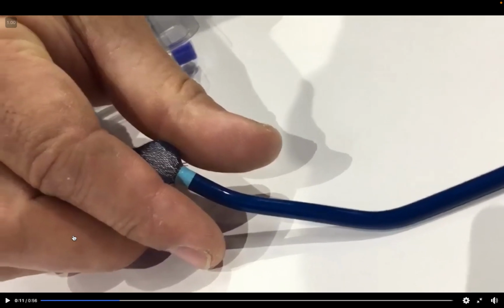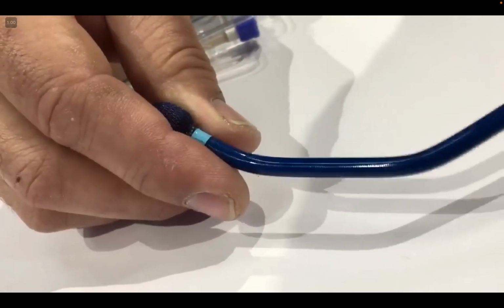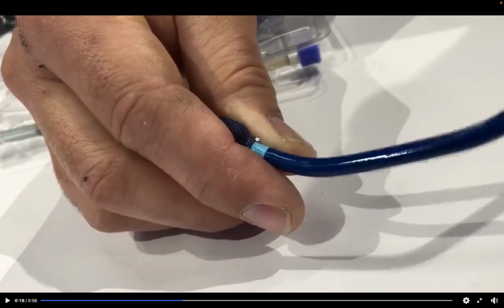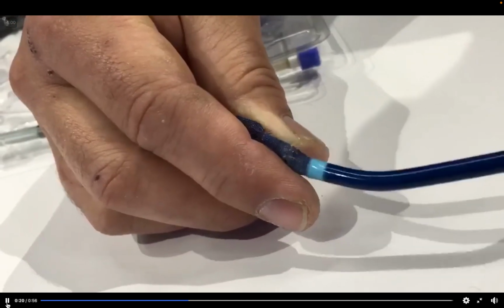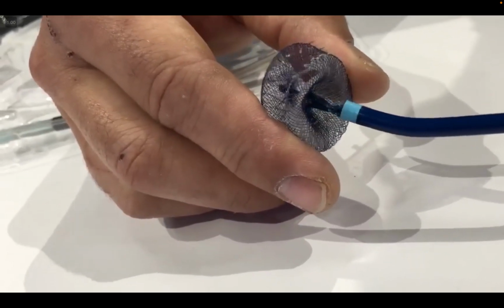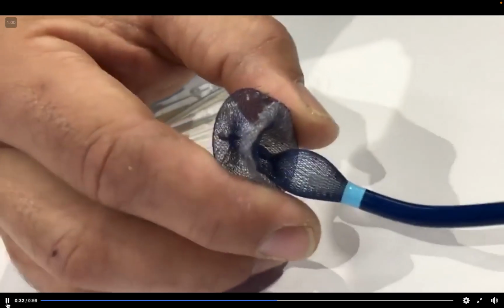So you can see the self-expanding nature of this actual device through this outer sheath. I'm not sure if this is 14 or 16 French, but this is a very large sheath. You can see there are penetrating hooks or wires that allow for anchoring stability. The material in here, is this to help with endothelialization? Yeah, it's polyester mesh.